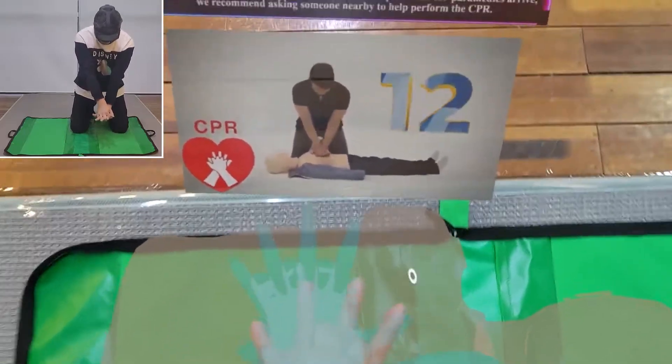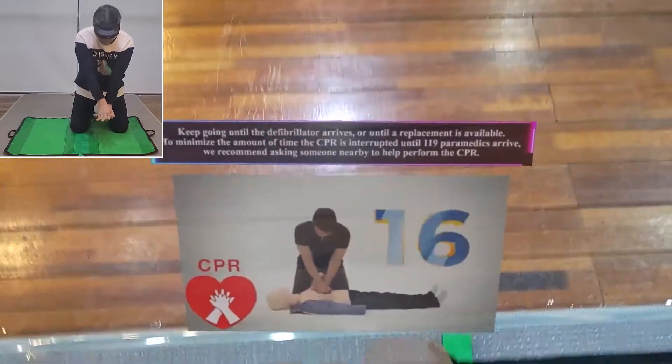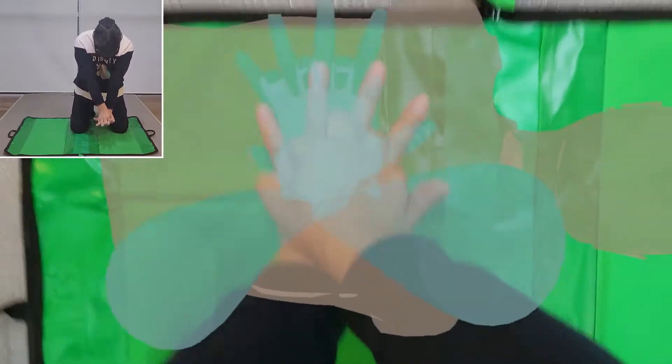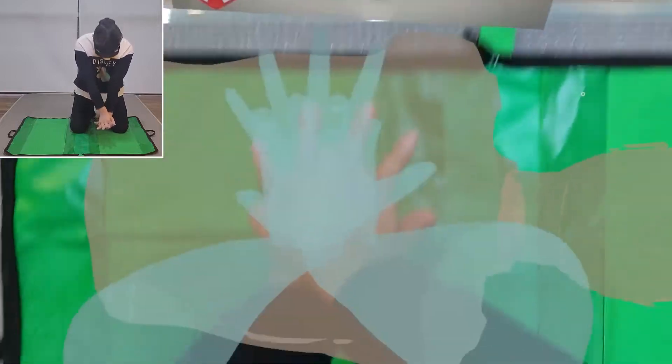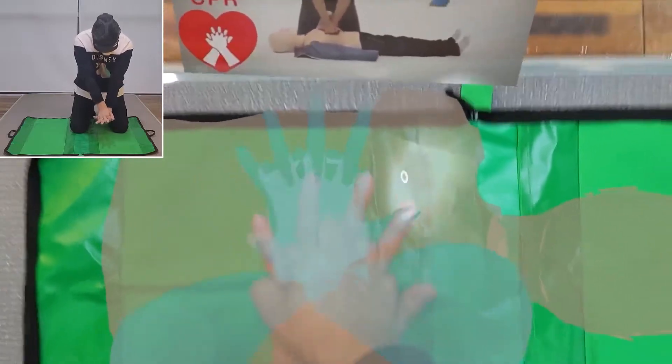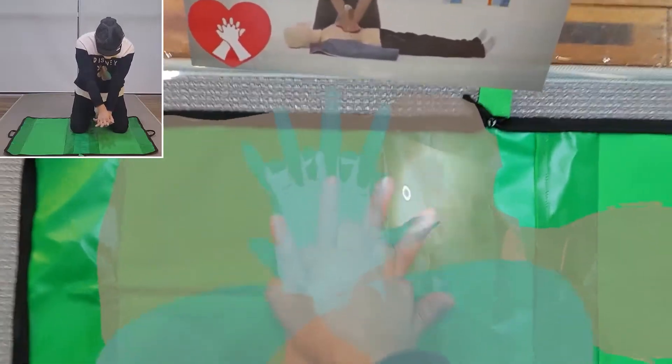Keep going until the defibrillator arrives or until a replacement is available. To minimize the amount of time CPR is interrupted until 119 paramedics arrive, we recommend asking someone nearby to help perform the CPR.